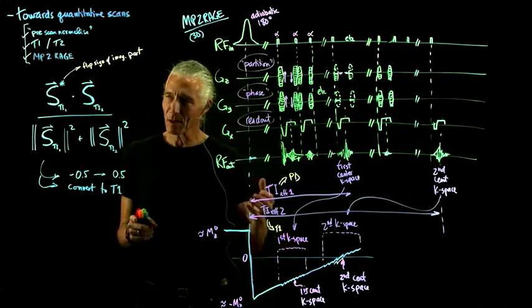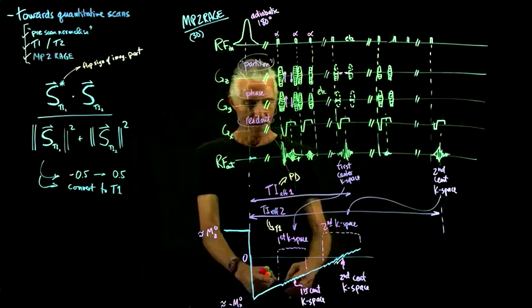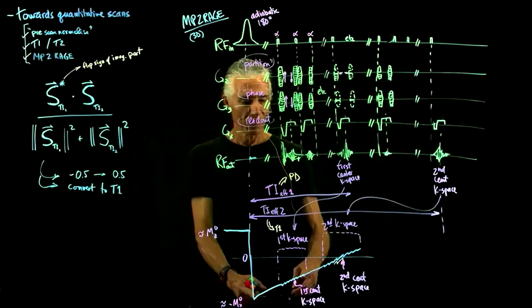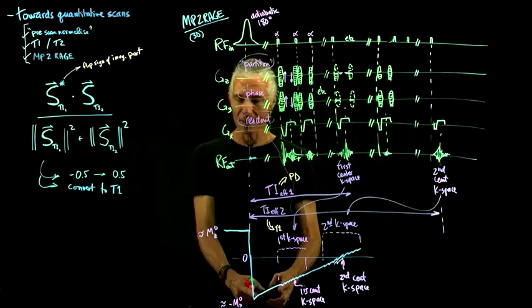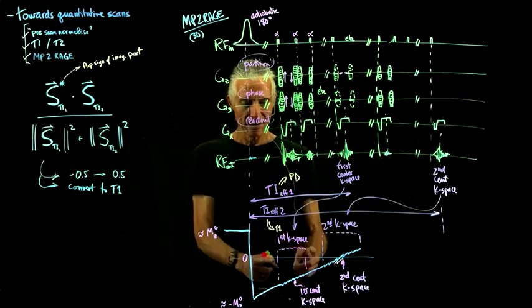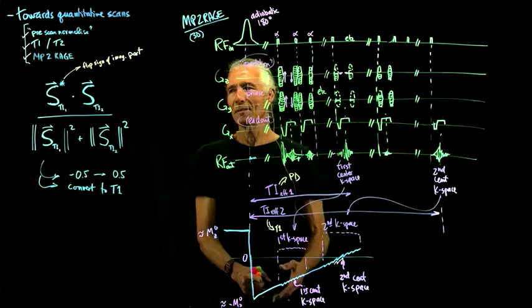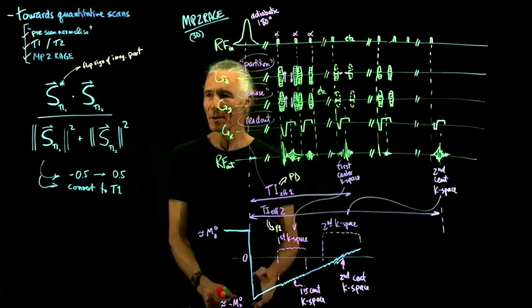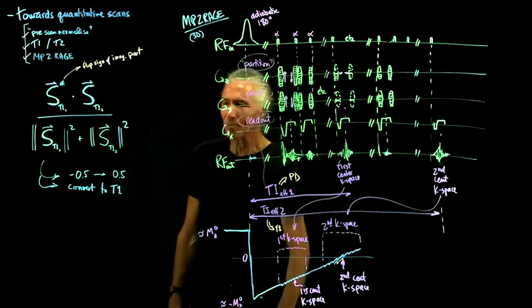It doesn't take very much longer than a regular MP RAGE, because in a regular MP RAGE, you'd wait longer before you started recording for some recovery. But here, I exaggerated the amount of time here, you can essentially start this proton density weighted scan very early, using time that you would have just been sitting around in the regular MP RAGE. It does take a little bit longer. But what's the problem with this?